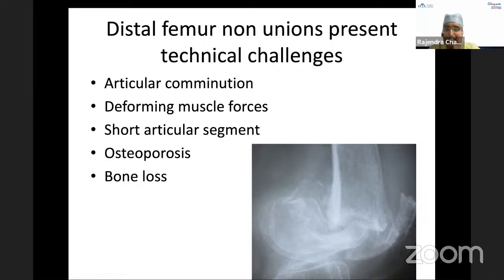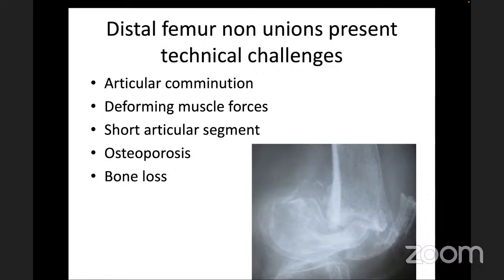Yeah. But can we have a CT picture for this? I think CT would be throwing much light on it. Yeah, the CT was there, but I have not kept it in the presentation. Okay. Anyway, replacing the distal end femur with a tumor prosthesis would have been a better option. But here, he appears to be young because there is no arthritic process. There is a distal femur which is there. So the clinical picture.